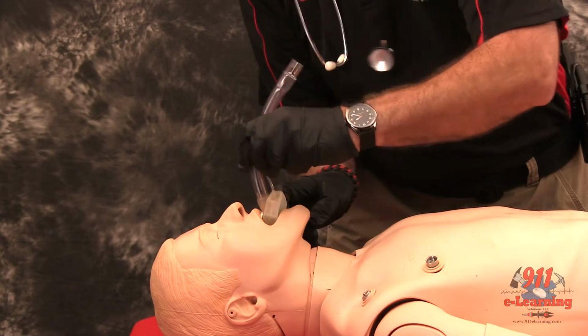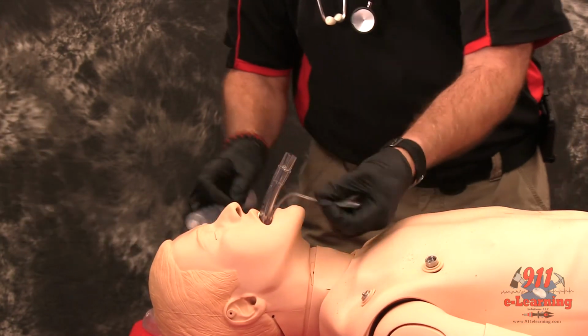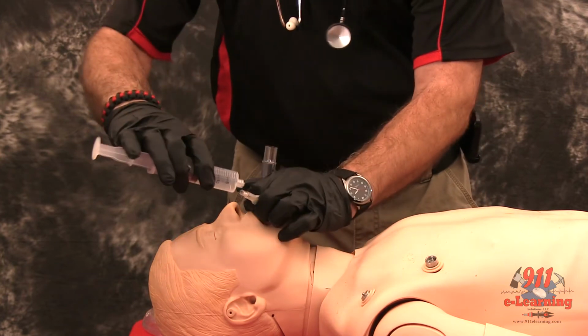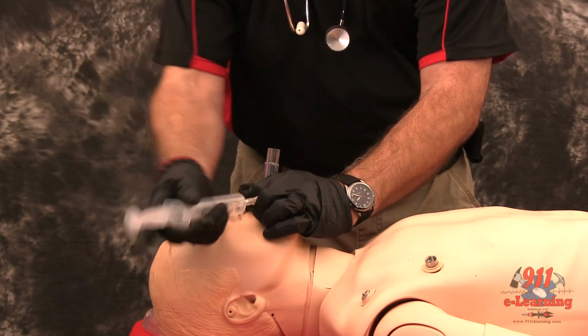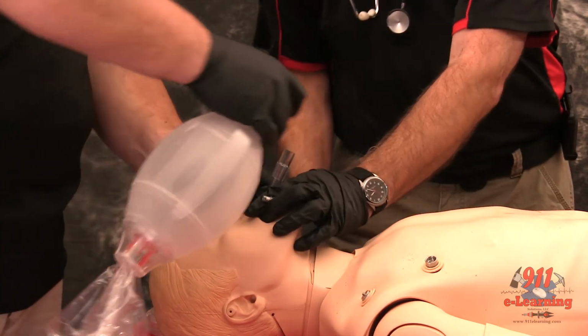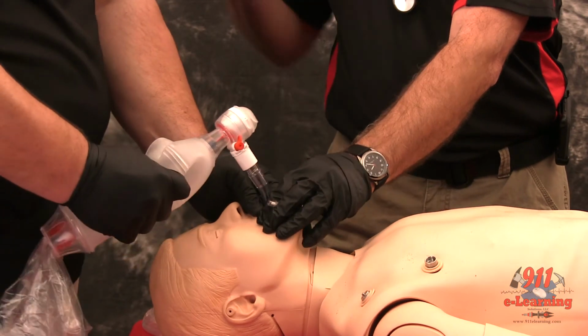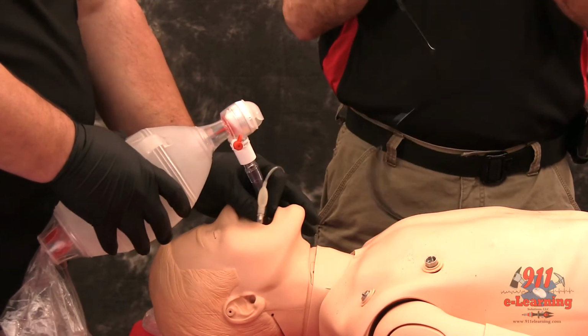Insert the LMA into the hypopharynx until resistance is met. Inflate the cuff until a seal is obtained. Connect the LMA to an ambubag and assess for breath sounds and air entry.